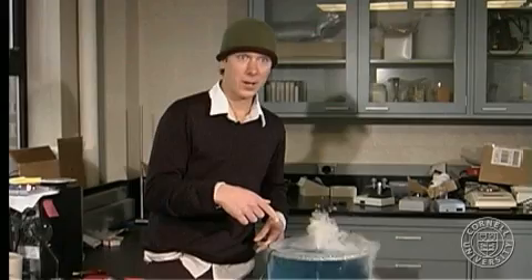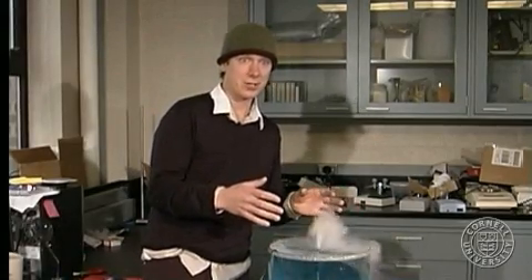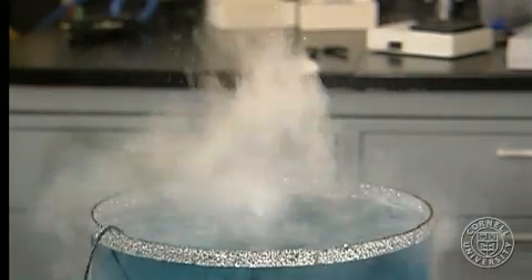Right here we see the ultrasound transducer which is in the water. It's getting converted from electrical energy into sound energy. And as the sound energy travels through the water to the surface, the energy is released in levitation of the water spurting up and the breaking of water molecules called cavitation. And that's the scheme.